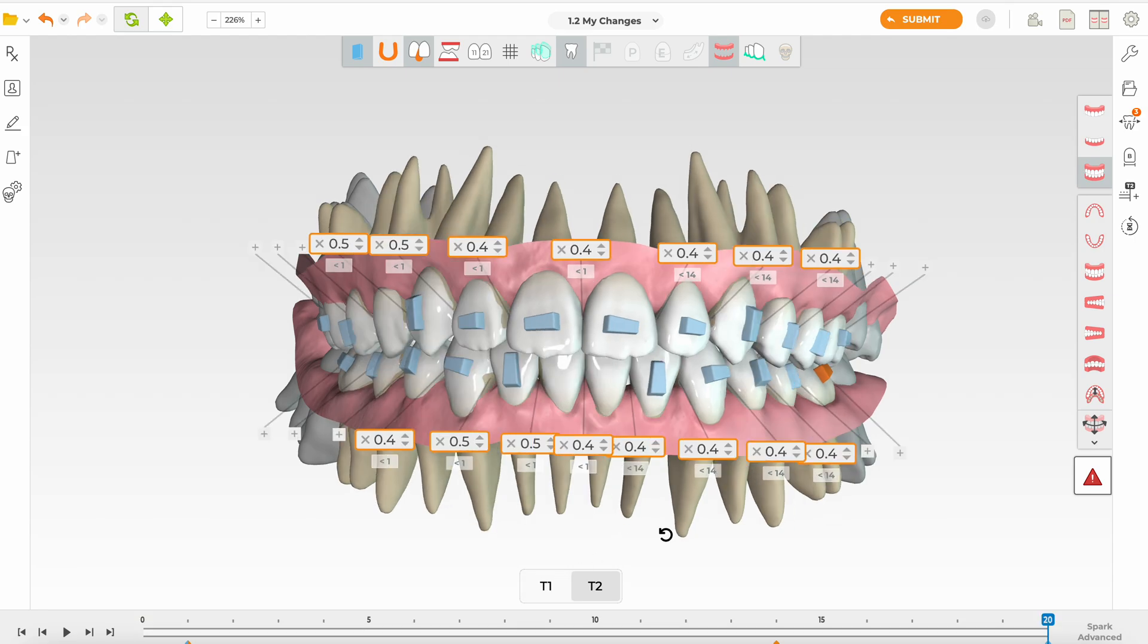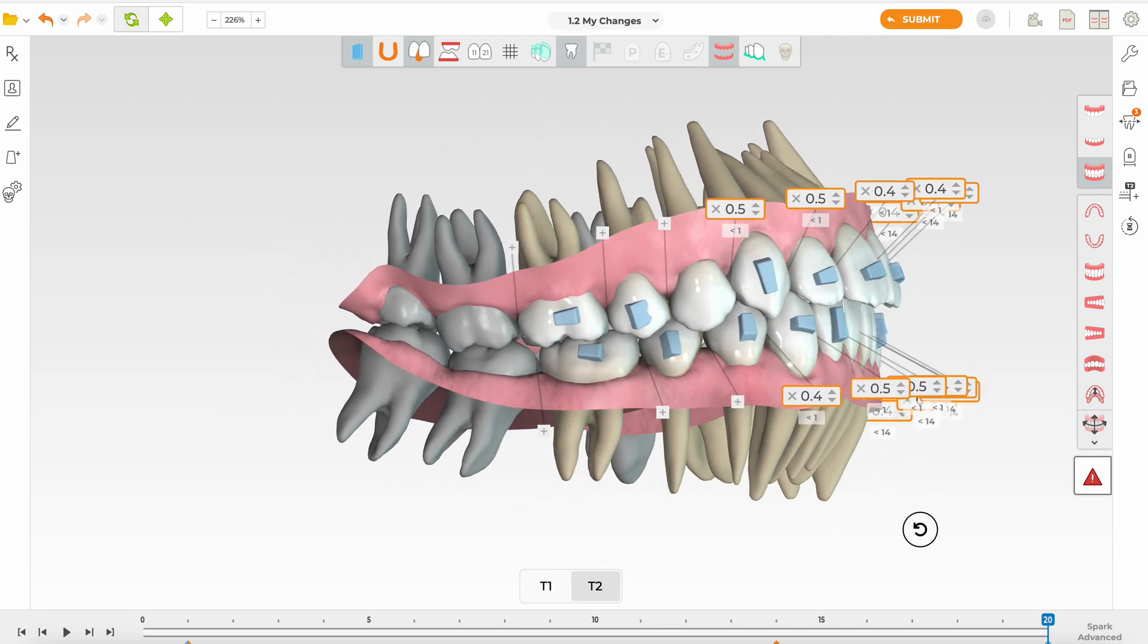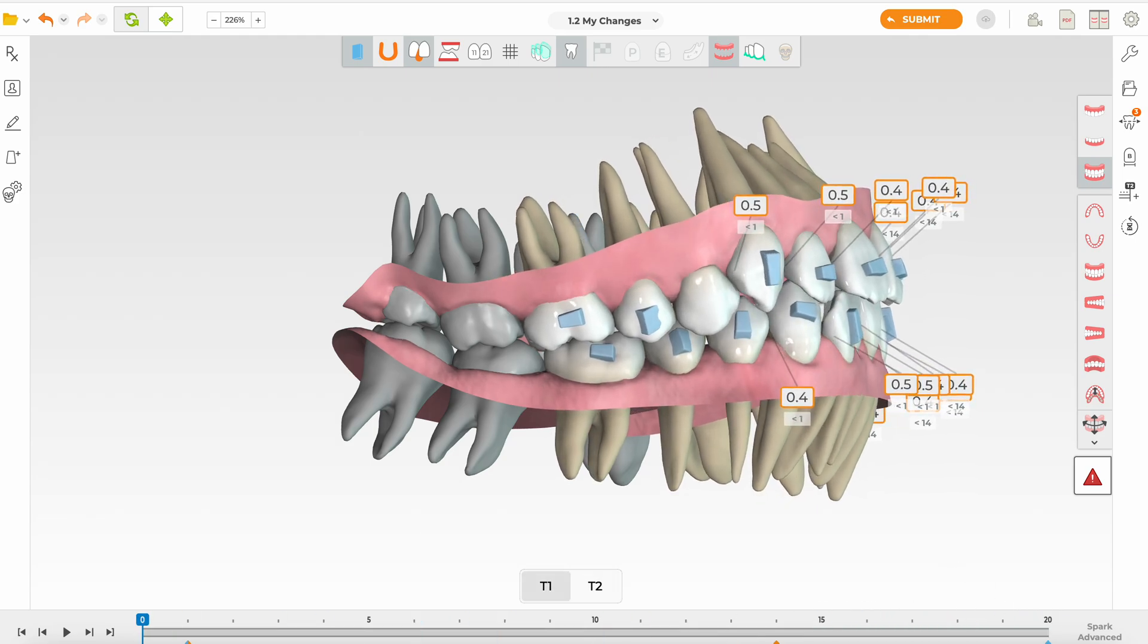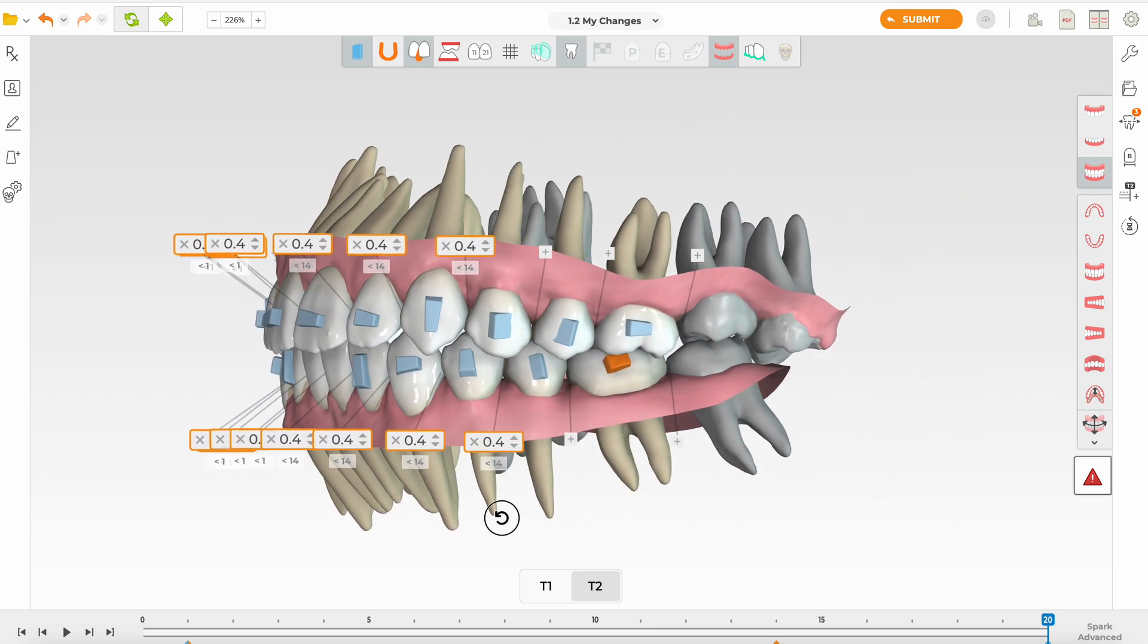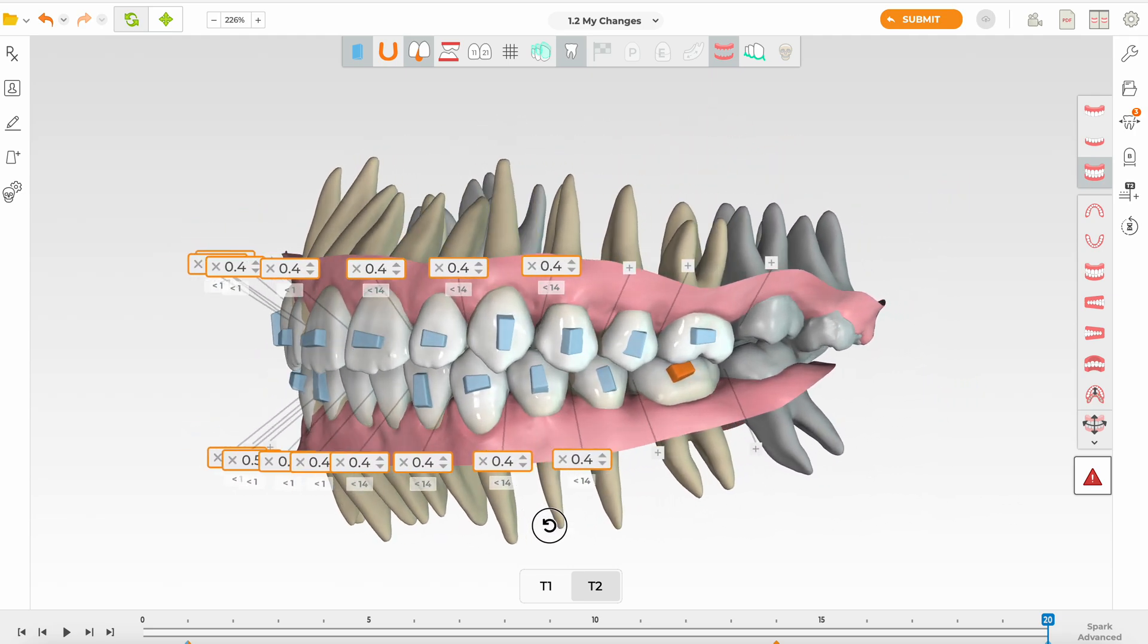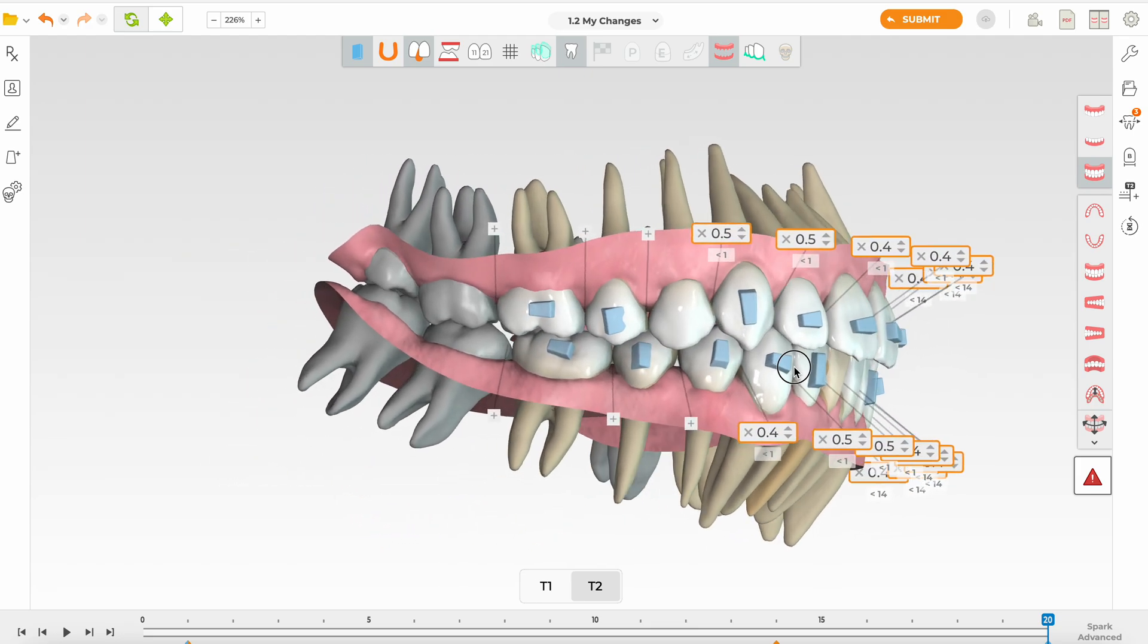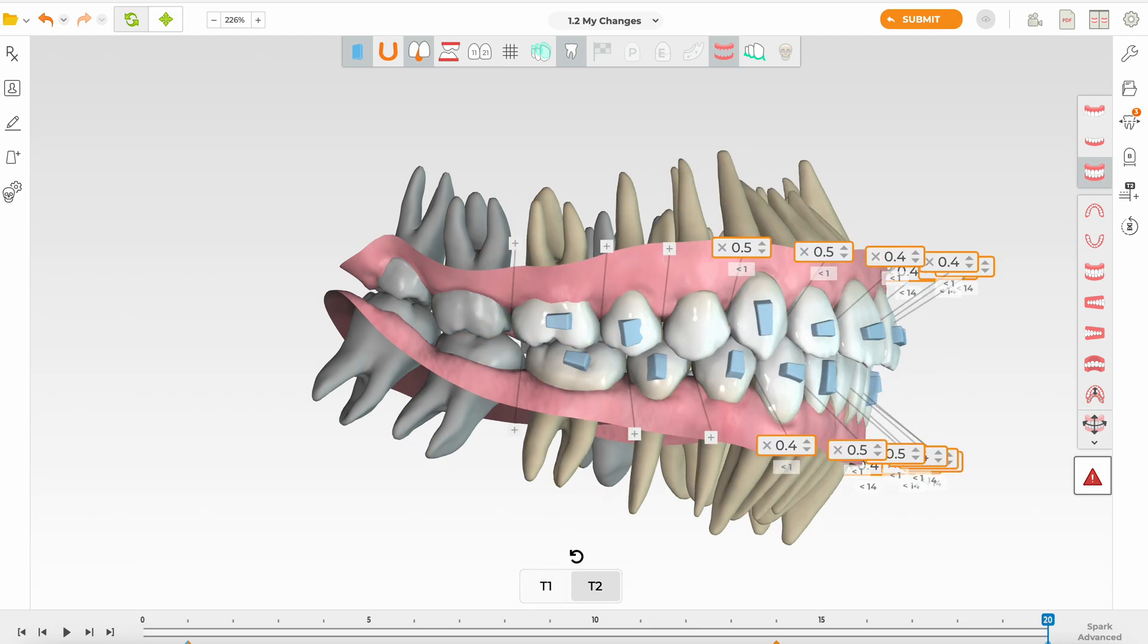I really think this is a case of bimax protrusion where I want to create an overjet and overbite, so I've got a lot more IPR than before. I've also limited expansion but at the same time limited posterior movement. The grayed out teeth I asked Spark not to move. Typically I do move all my sevens in an adult, but in this particular case I want to hold them.